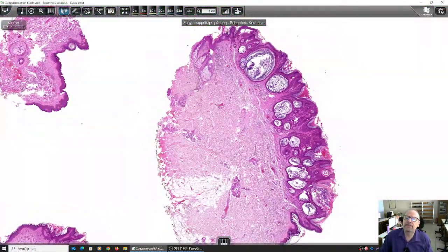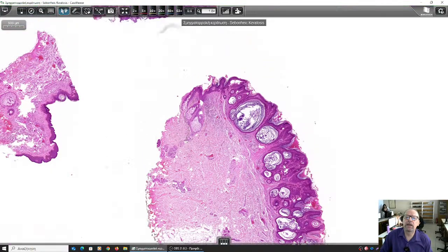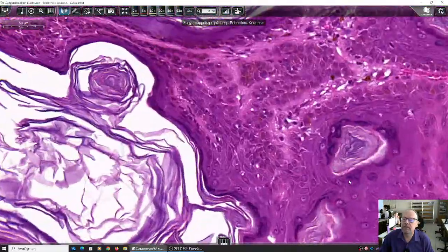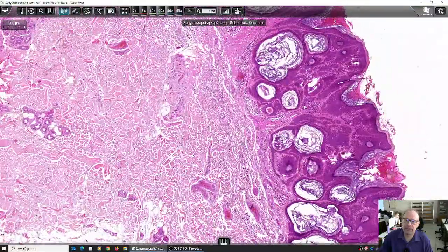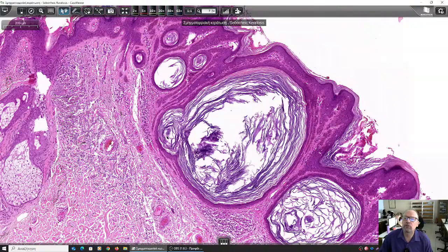Anyway, this is an exophytic lesion composed of epidermal cells, mainly basal cells, but some squamous cells participate in the lesion as well. I can see that we can identify them. Yes, these are squamous cells. You see? The squamous cells, here they are. And they have some cysts here, which are filled with a material that I'm sure you can identify. What material is this that appears to fill all these small cysts?